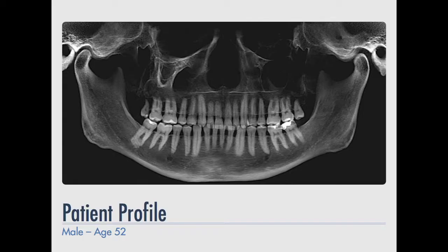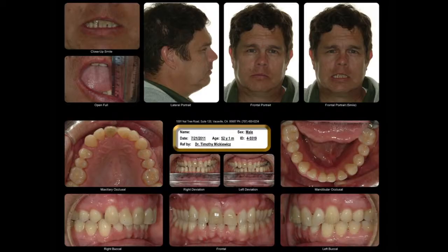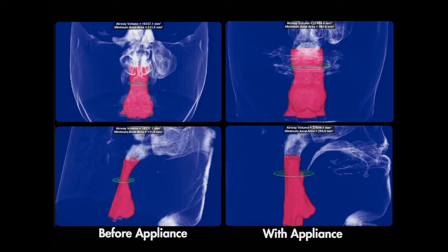This is one of our patients. Classic. It's 52, 55 is the most common. Bulldog jaw, big, heavyset guy. Grinds like a maniac. Look at these teeth. They're just all worn down, broken, bridges everywhere. And a retrognathic profile. When the teeth are kicked back, he's also retrognathic. So before and after, you can see the volumetric changes.